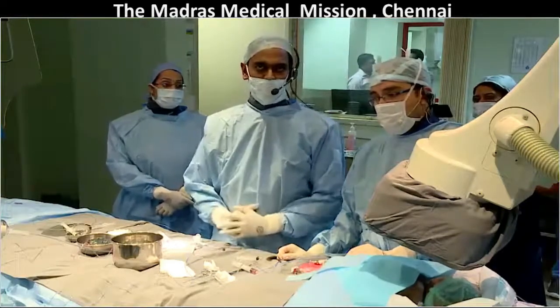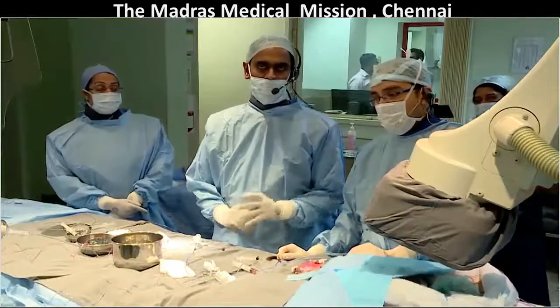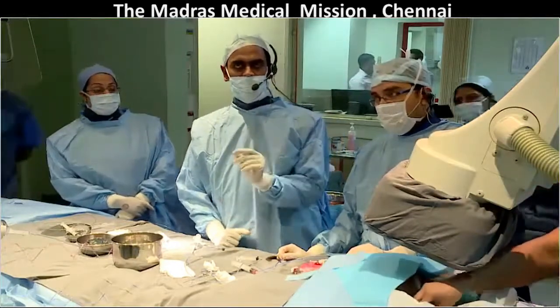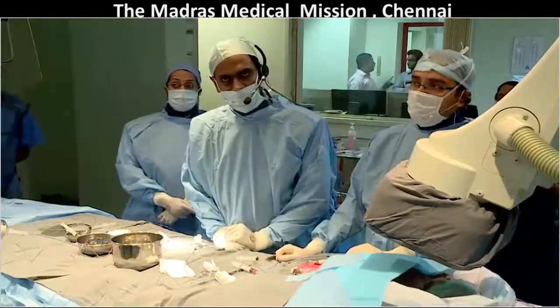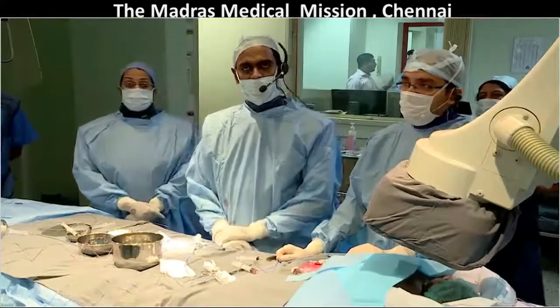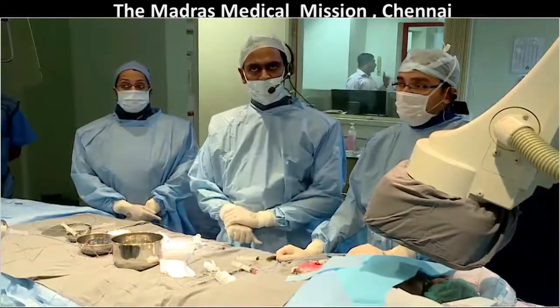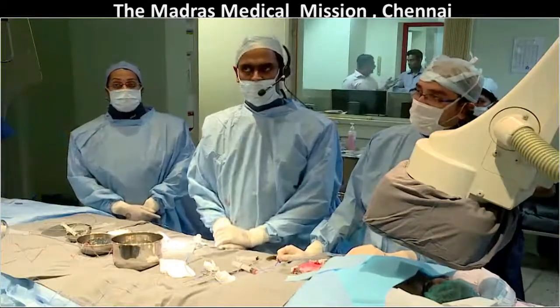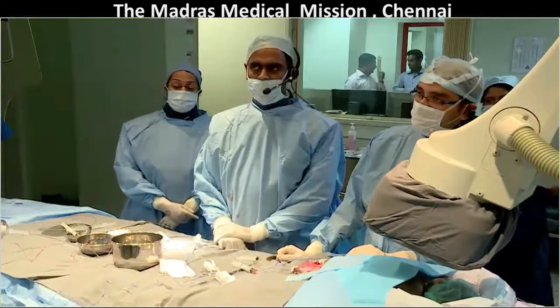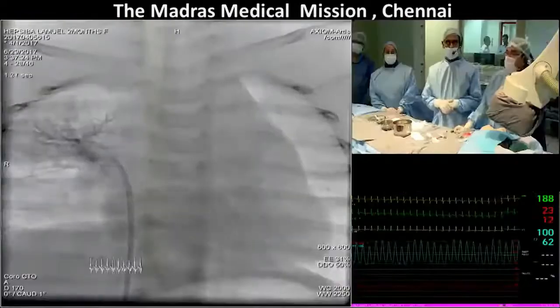With the fall of the pulmonary vascular resistance, the gradients have come down, and we are finding that the fistulous channel that we are seeing is progressively increasing in size. What was measuring about 2.5 millimeters in the neonatal period is now measuring about 5.5 millimeters. And so we decided to take up this child for a diagnostic study. I'll just show you the anatomy that we have got. Can you go on fluoroscopy?